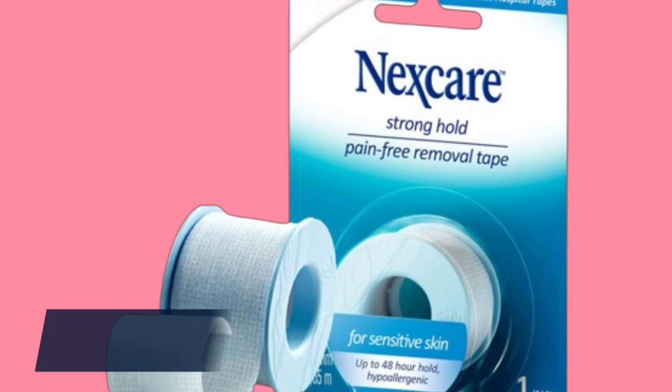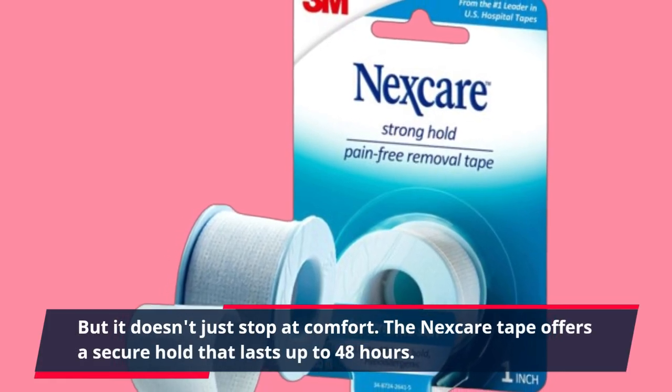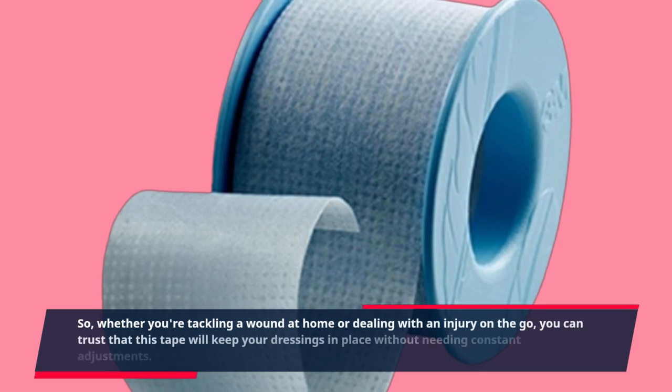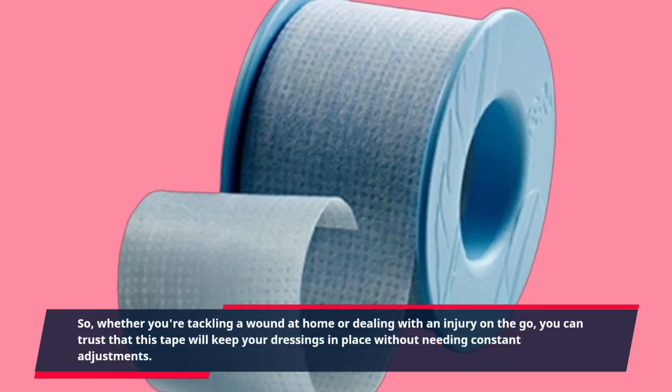But it doesn't just stop at comfort. The Nexcare Tape offers a secure hold that lasts up to 48 hours. So whether you're tackling a wound at home or dealing with an injury on the go, you can trust that this tape will keep your dressings in place without needing constant adjustments.